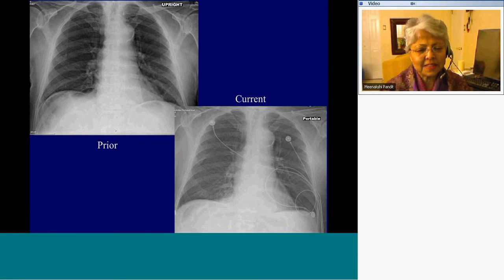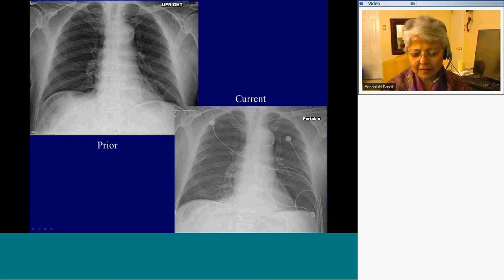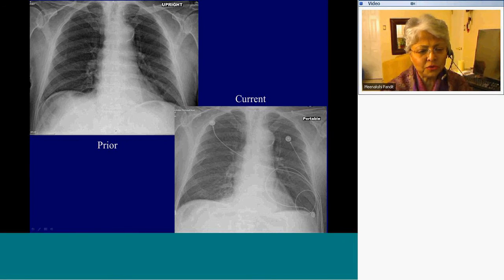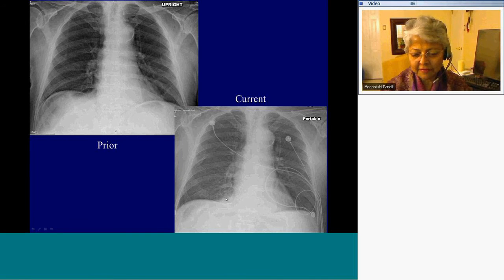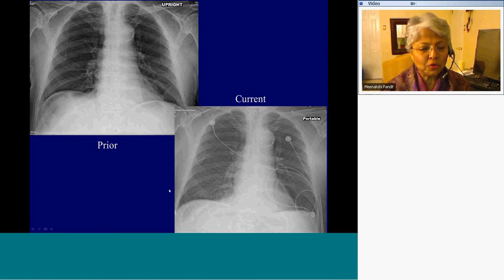Being simple, let's get to some really complicated, challenging cases. This is a prior radiograph and this is the radiograph we are dealing with. This is how the posterior basal segments are equally lucent on the prior, and on the follow-up radiograph, the density we see in the paraspinal region is lost. So there are bibasilar posterior opacities, mostly caused by aspiration.